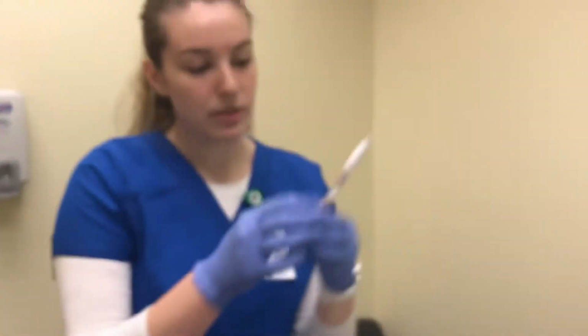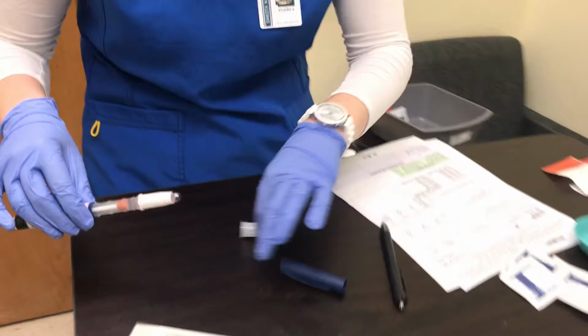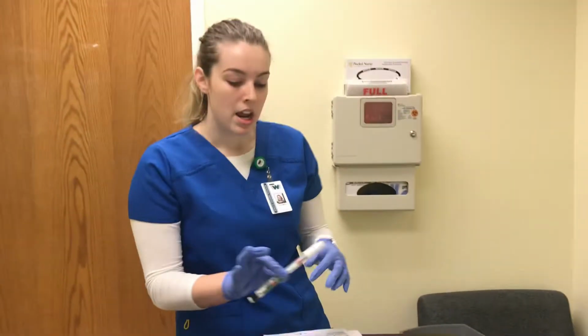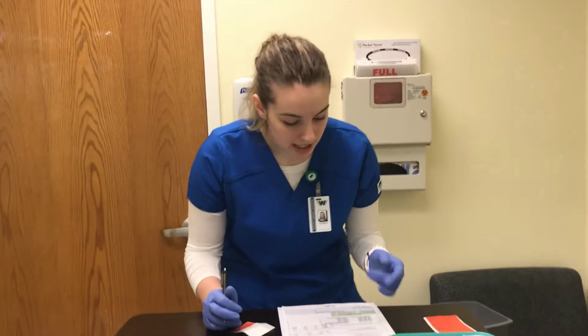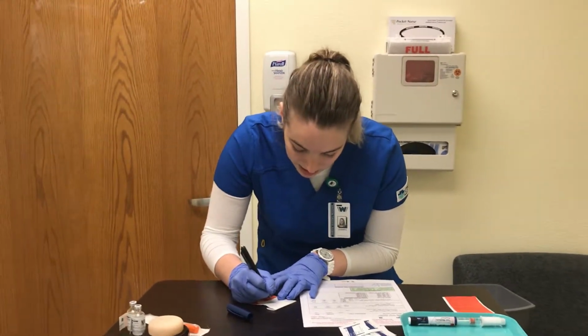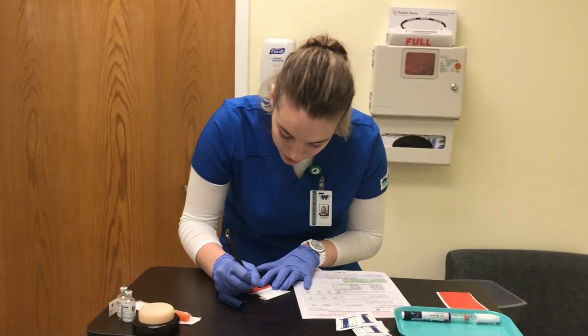Okay, verified to 2 units, and then I will do the one-handed scoop method and pull down at the top. And although this does have my patient's name on it and all that, I'm still going to put a label on it, because then I know exactly how many units I drew up. So this is my insulin pen, so this is Lispro, and I have 2 units.